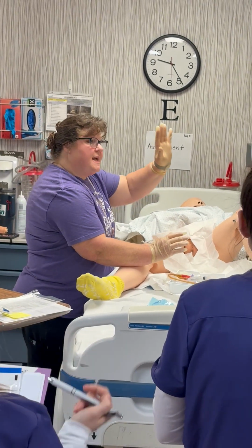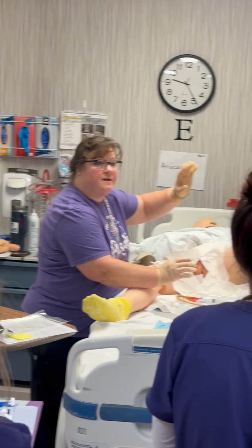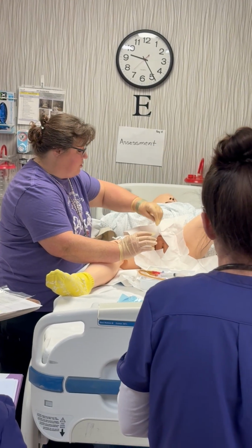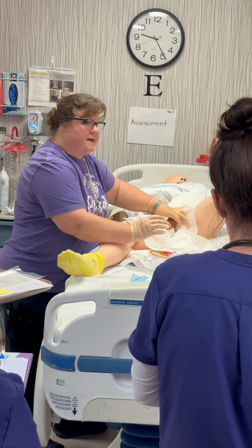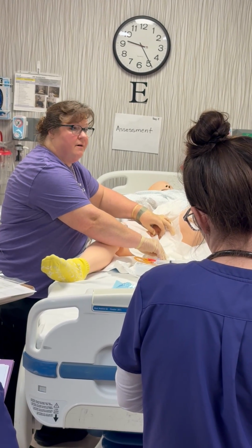So now this hand, your non-dominant hand, is going to be non-sterile now, okay? Because I'm going to touch her. So when you touch, you're gonna open up those labia, okay? And you're gonna wash that area first.